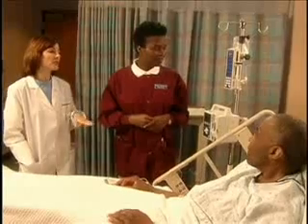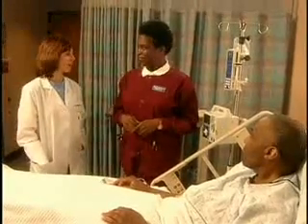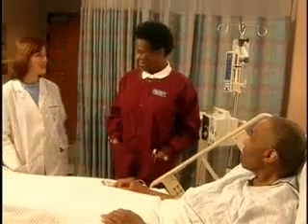You should assess Mr. Nixon and the pump about 5 to 10 minutes after the infusion starts to make sure everything's working properly. Okay, cool. We'll have a nice chat. All right, I'll leave you to it. Looks like things are under control. Okay. Thank you. How are you, Mr. Nixon? Great.